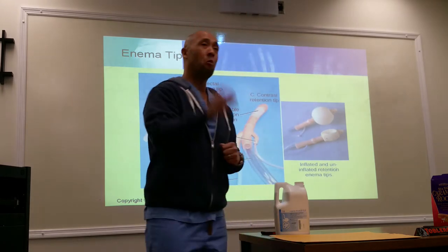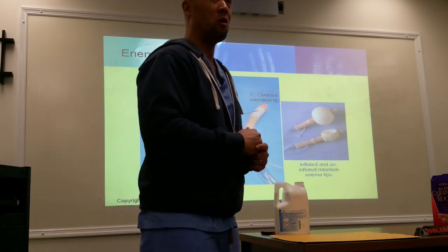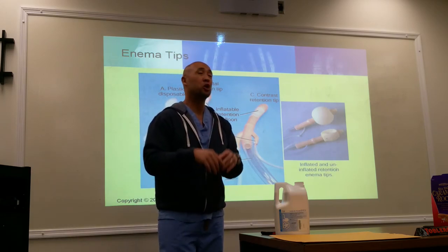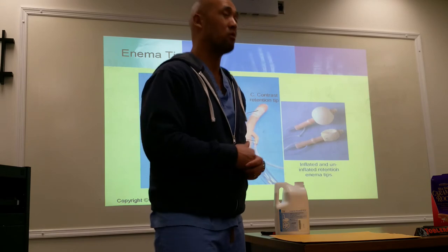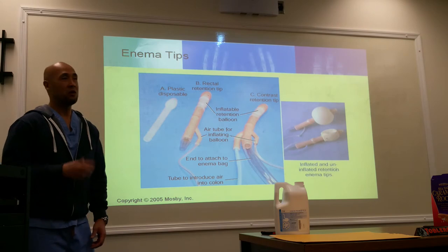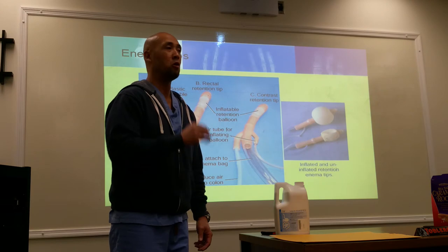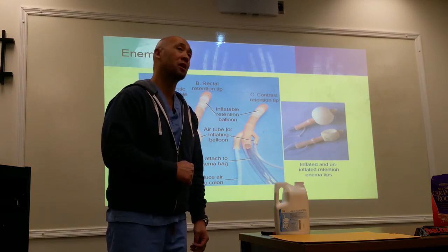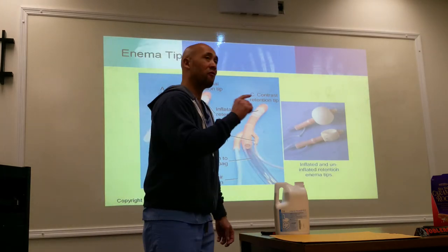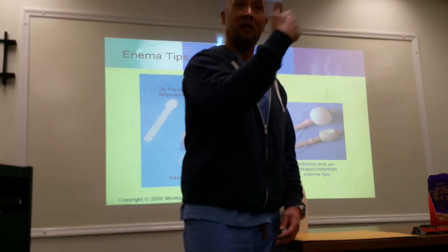So one of the important things that you're going to tell your patient is, Miss Jones, I'm going to put this rectal tip here in just a moment. You're going to feel like you're going to want to go to the bathroom. Don't push. We'll try our very best to get through this as quickly as possible. Do you have any questions? That's part of your dialogue. So again, you're going to feel like you want to go to the bathroom. Do your very best to hold it in, and we'll do our best to go through this procedure as quickly as possible. One of the other things you're going to tell your patient during the fluoroscopic portion of this is to let them know that they will be moving around in different directions.